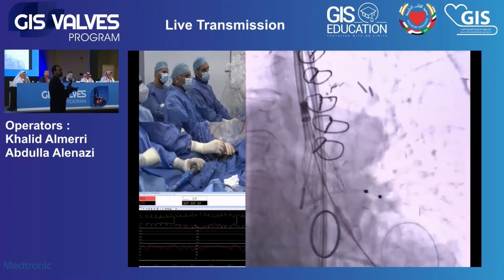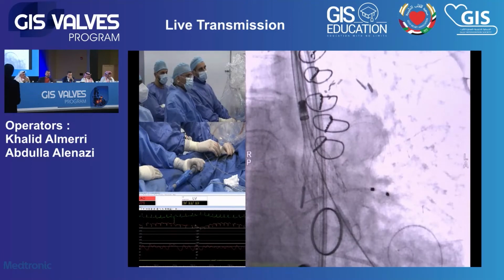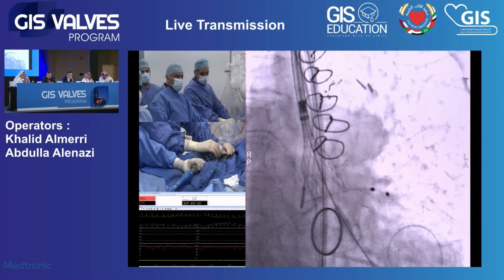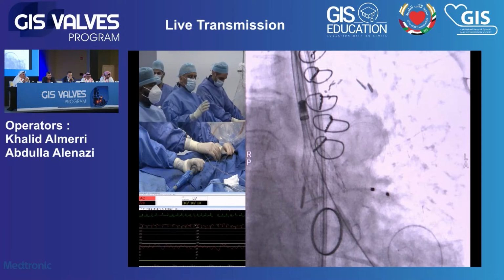Dr. Khalid, Dr. Lafont suggests that pacing should be continuing. Is that something that you consider, or why do you stop at this stage, because you want to avoid any pop-out or something at this stage? Yes, we will pace when we release the valve. So we pace twice. Right.